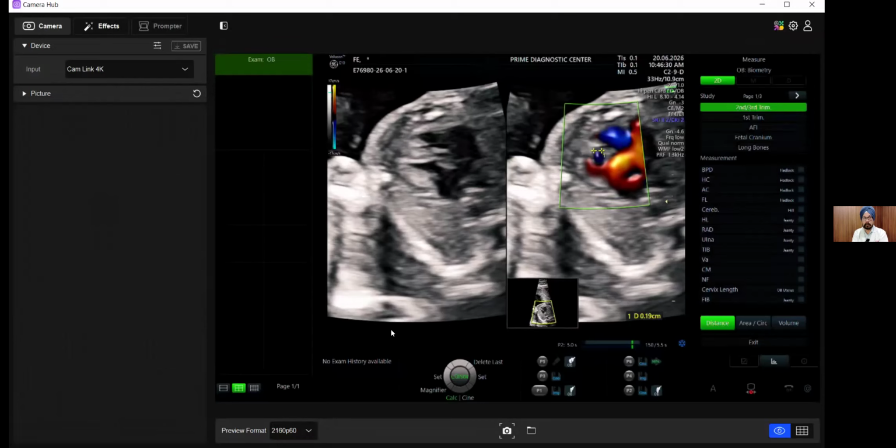So that large perimembranous VSD would actually announce itself when you are doing a 2D scan by a dropout area. Now, applying the same rule of reducing the Nyquist limit and reducing the gain would not really be very helpful in the subaortic area or a perimembranous area.